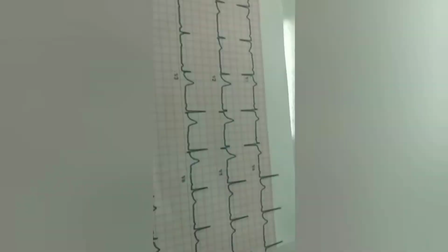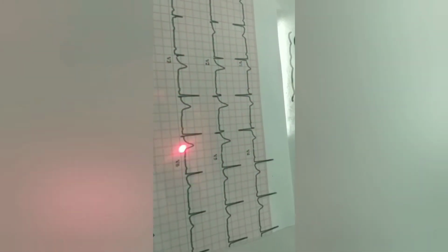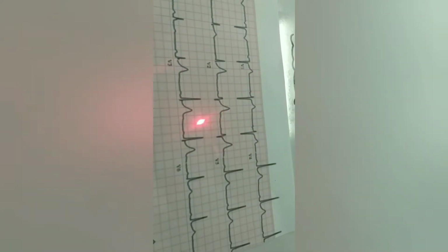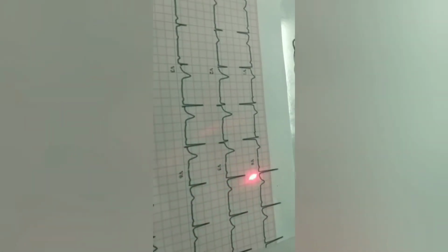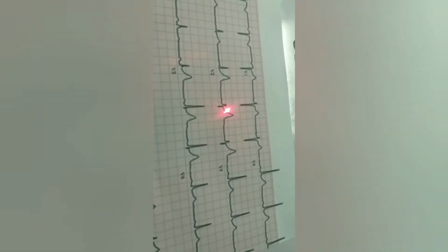If you look at the leads V1 to V6, which represent the anterior wall on the ECG, in a normal ECG there is no ST elevation, there is no T wave inversion. If you look at this J point, this is the S wave, this is the T wave. So the junctional point hasn't gone up.